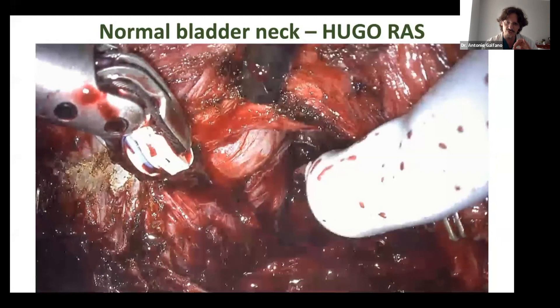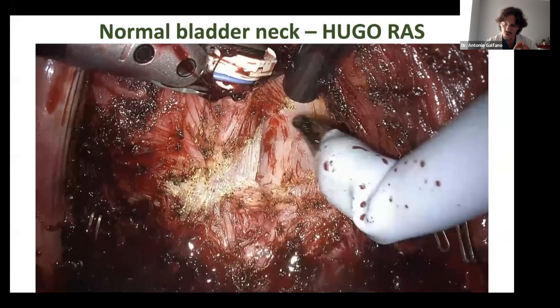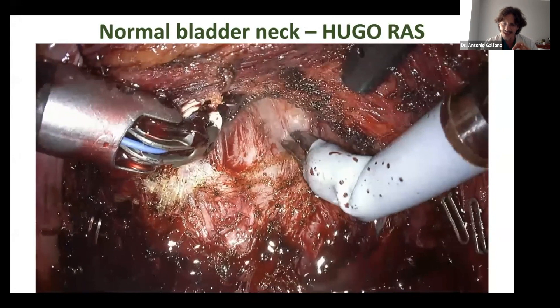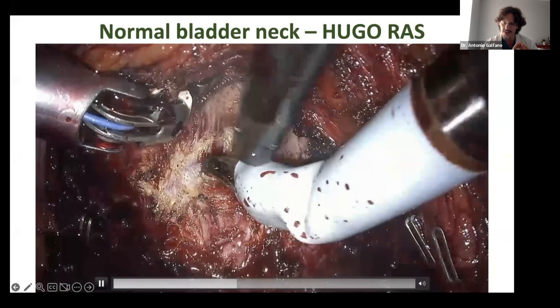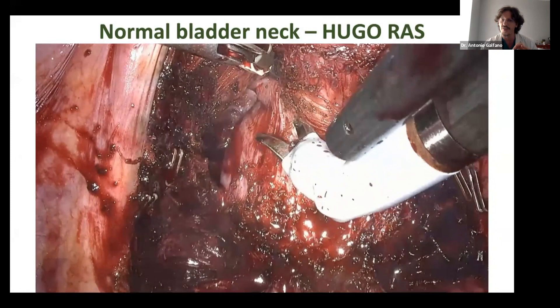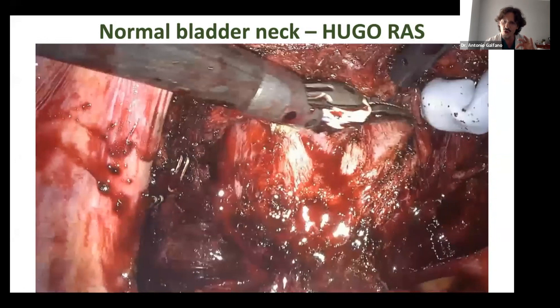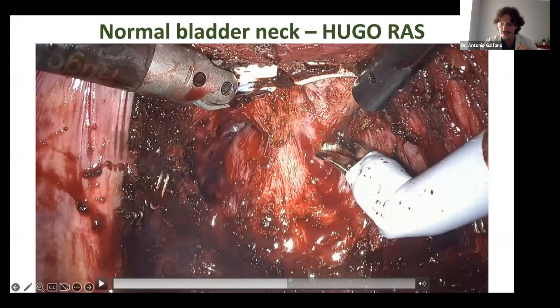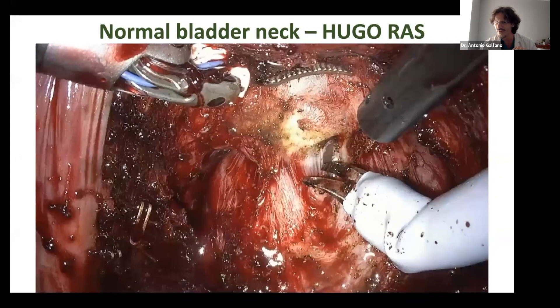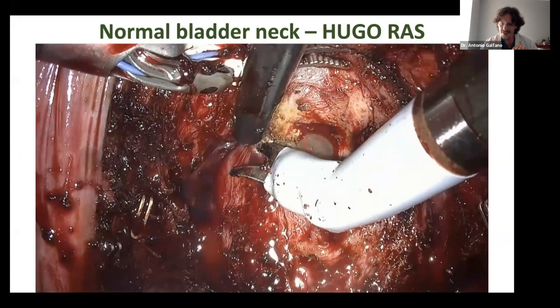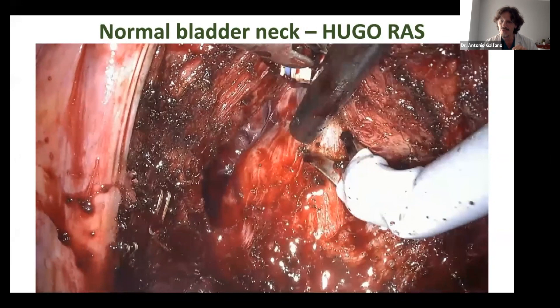The trick is always to surround the bladder neck following the shape of the prostate. Even when we perform a formal sparing of the bladder neck, I still try to leave some muscle fibers attached to the prostate — this is the safe side to avoid a positive margin while still sparing the bladder neck. Going from lateral to medial, you always find a V-shaped bladder neck with fibers attached to the prostate on each side. I'm incising the mucosa, which bleeds also from posterior, not only from anterior. Following the catheter and continuing to surround the bladder neck, we go onto the anterior part.